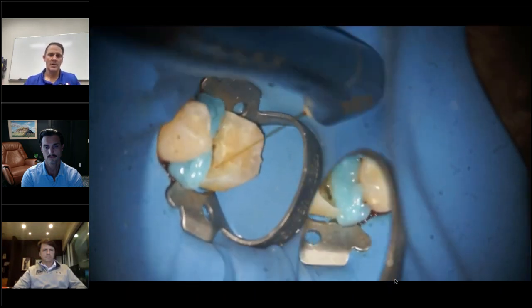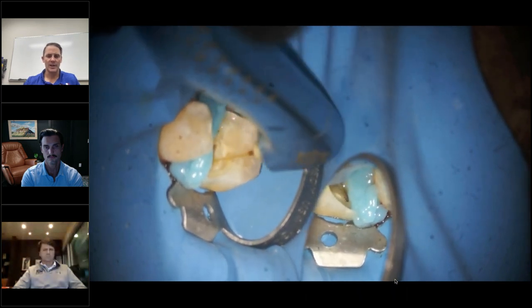And the syringes that I typically use, if it's a molar access, I just put an etch tip on there, just fill the chamber up. If it's a small one, then I'll put the 27 side vent needle or something on there. We'll go back in there now. You can see there's really no heme coming out of it now. So cleaned out that resorptive defect, and you're going to see that on the post-op image here. You'll be able to tell where it was there.